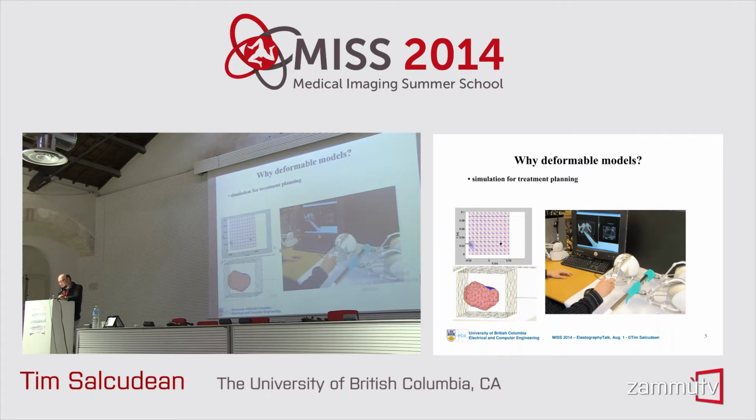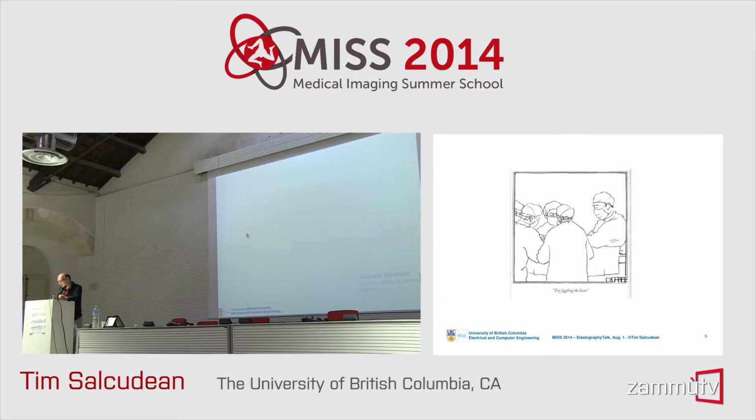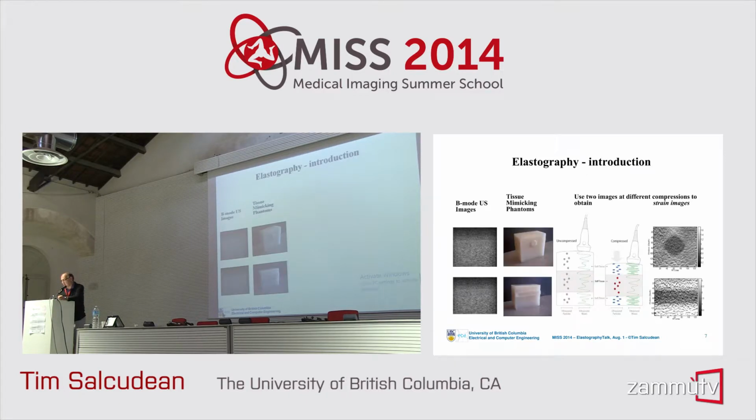So in order for us to understand how tissue gets deformed when you actually poke a needle through it, it would be really required for us to know the underlying mechanical properties. Very simple: I'm sure everybody who's been in a surgery and looked at the open abdomen has had this irresistible temptation to try and jiggle the liver. And this is exactly what you're trying to do with elastography.